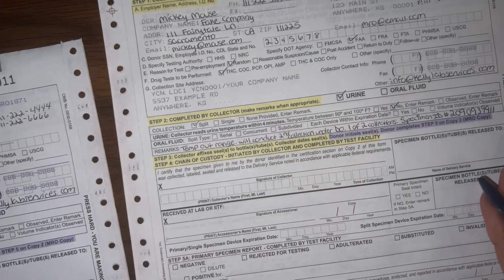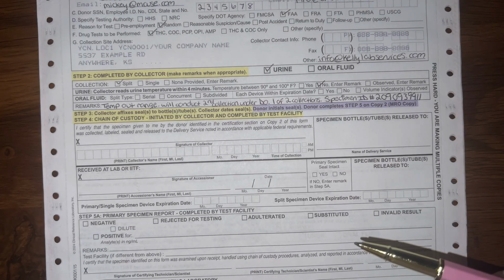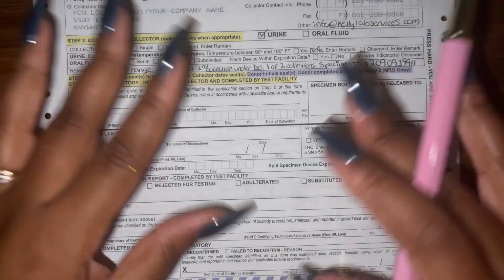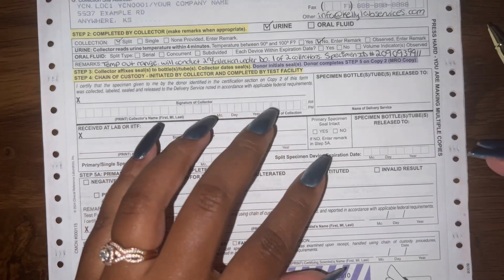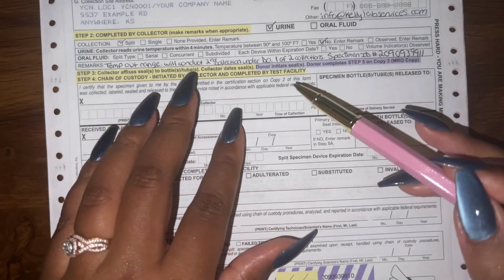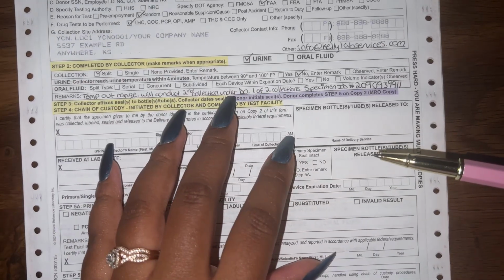Once we have that filled in, you're going to go ahead and split your specimen, apply your labels, date, donor's going to initial. You're going to move on through the rest of the steps like you normally would. Bag it up, because you are going to ship this temp out of range specimen to the lab, because the lab wants to try to figure out what the donor did. We want to analyze this specimen so we can try to identify what's taking place here.